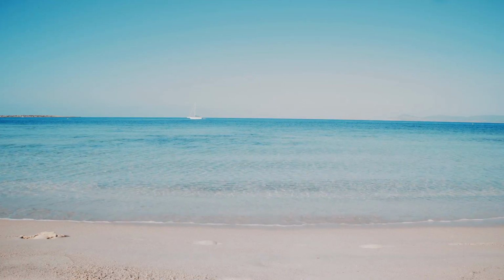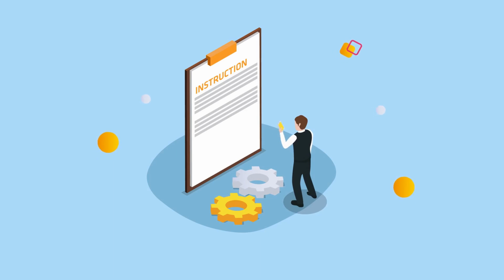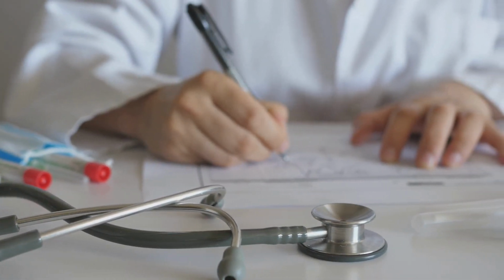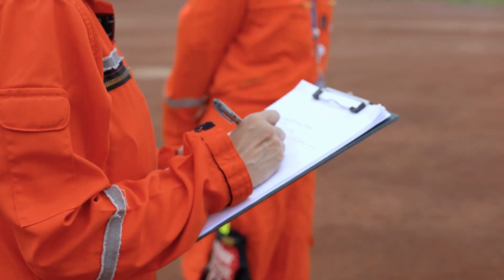Recovery time varies, but most men can resume regular activities within 4 to 6 weeks. It's essential to follow your doctor's post-surgery instructions carefully to ensure the best outcome. So, what's the takeaway? Penile implants are not for everyone, but they can offer a significant improvement in the quality of life for those who need them. Remember, it's all about making an informed decision that's right for you.